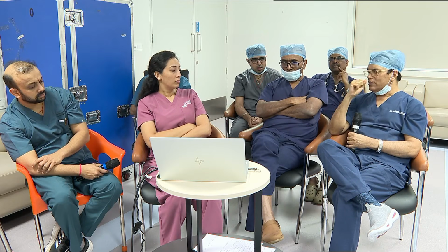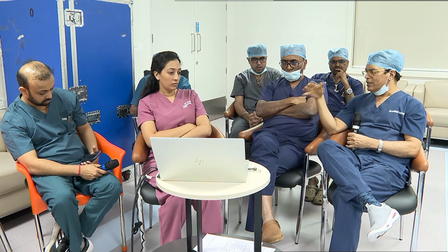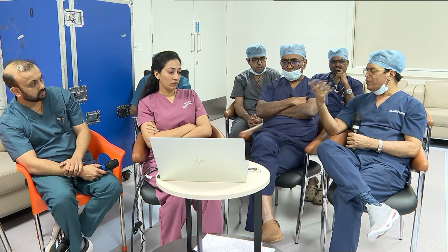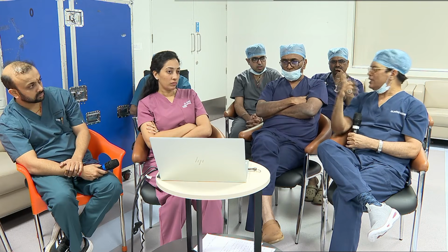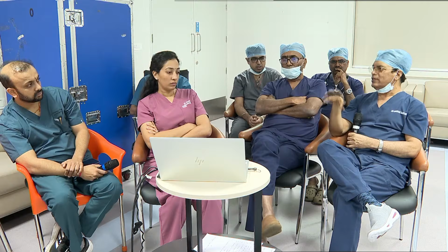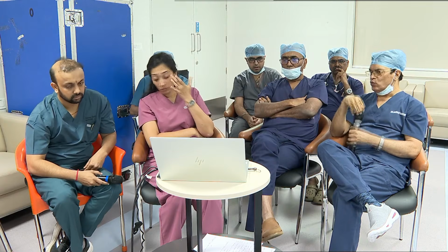I feel even at 60 to 65, especially with associated comorbidities, there may be a chance of another one 10 years later. If you go with a bioprosthetic valve, then there is a chance for another TAVR. Initially, even if you are doing it surgically, go for bioprosthetic, then go with another bioprosthetic like a self-expanding valve. The combinations are useful.